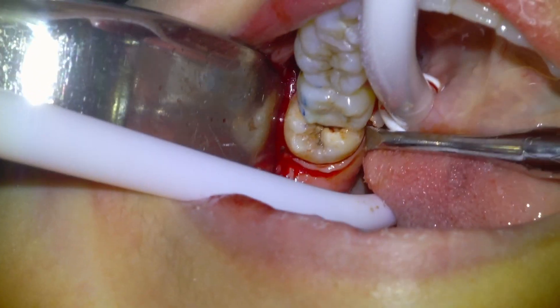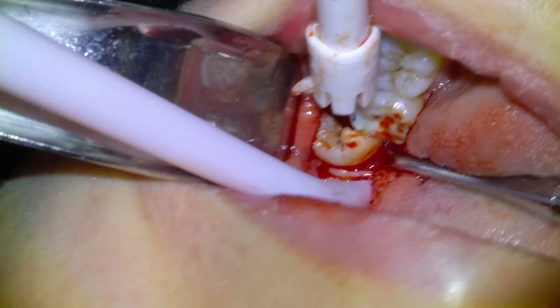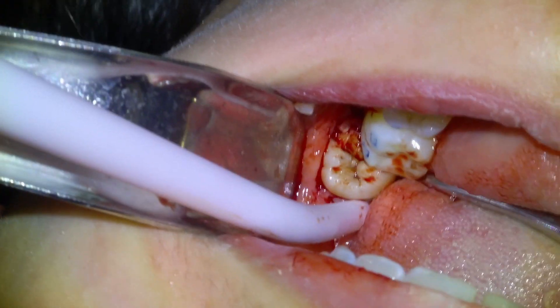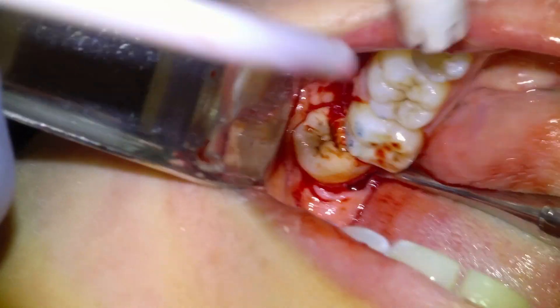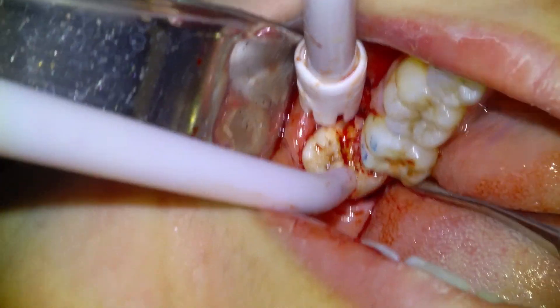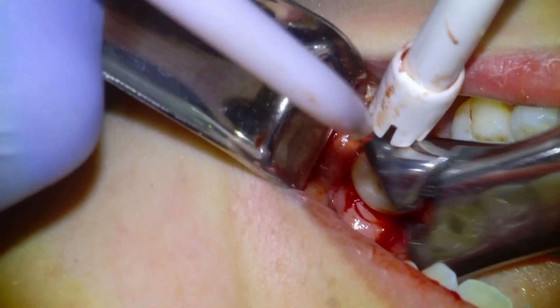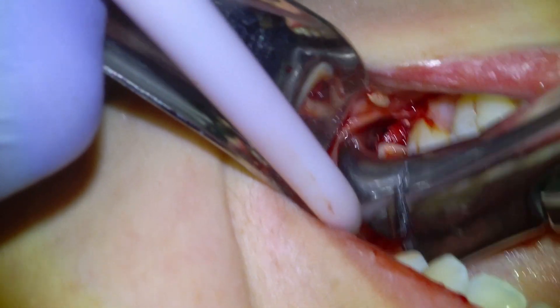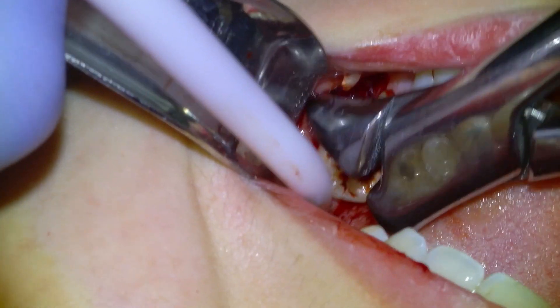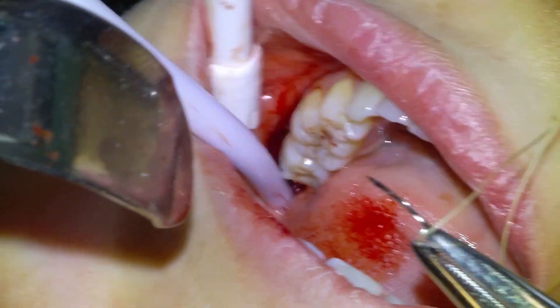We're going to give a little bit of elevation from the lingual here carefully, and then deliver the tooth with a pair of cow horn forceps. For pain management I typically just use Advil and Tylenol — 600mg of Advil and 1000mg of Tylenol preoperatively — and then advise the patient to take that two to three times a day for the next couple of days.